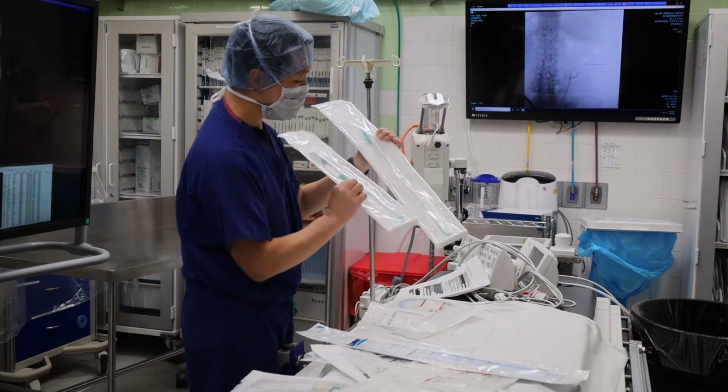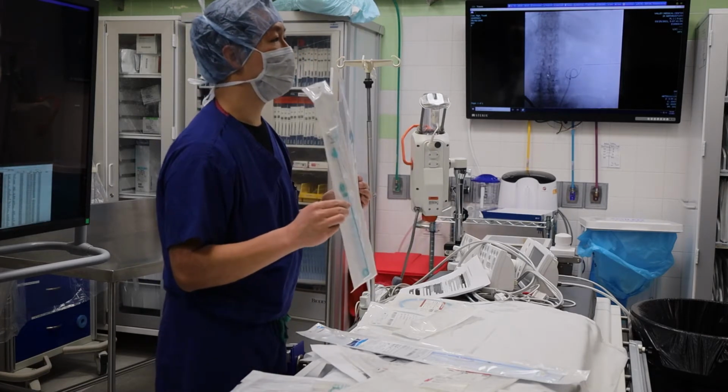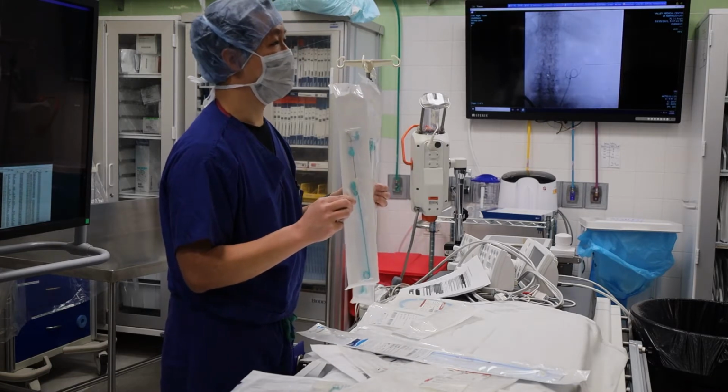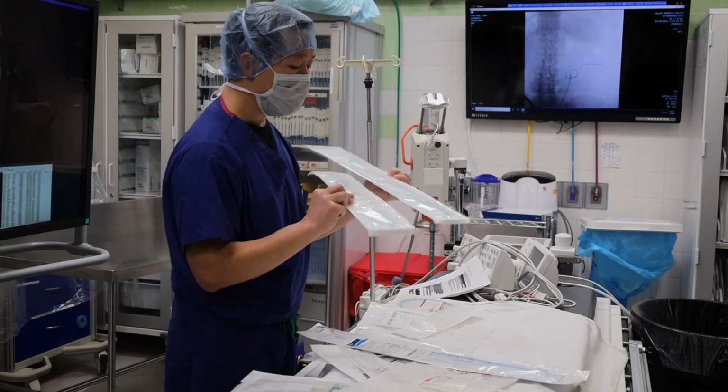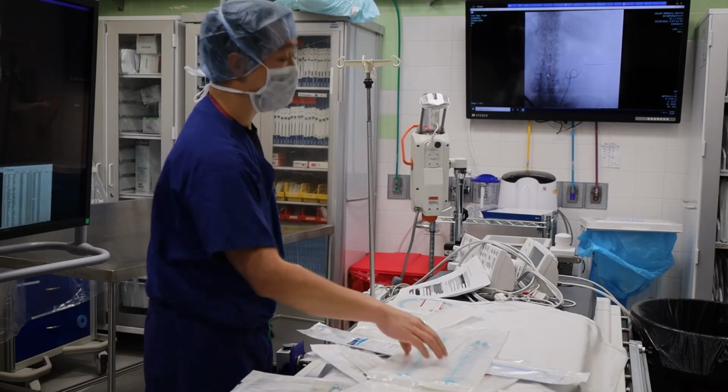What is the difference between a perc Neph and an APD drain? Where the holes are. Okay, what else? Good. The length of it. The length. Okay. So many people are going to be going home with a tube sticking out of the back.